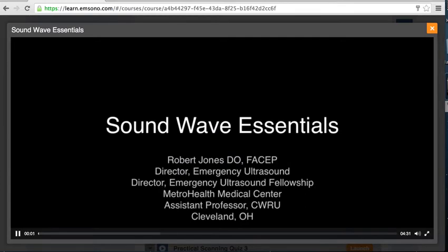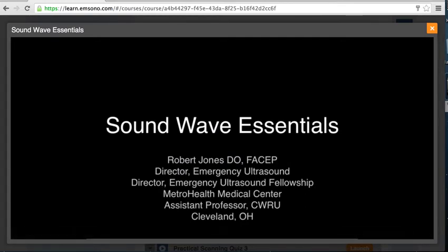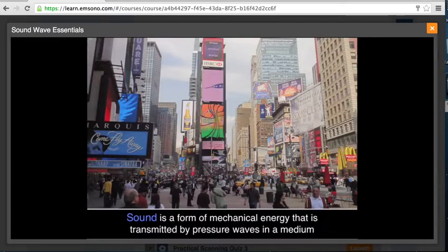I'm Dr. Robert Jones, and in this lecture we're going to cover sound wave essentials. Sound is a form of mechanical energy that is transmitted by pressure waves in a medium, and it is all around us in a variety of frequencies.